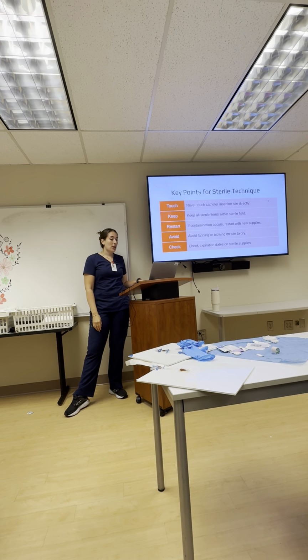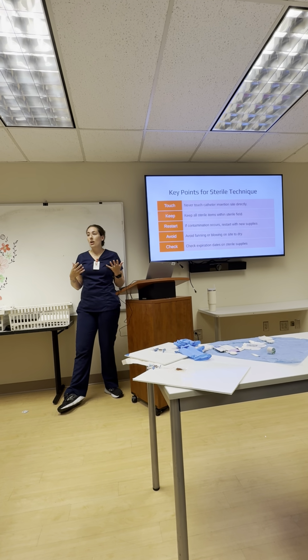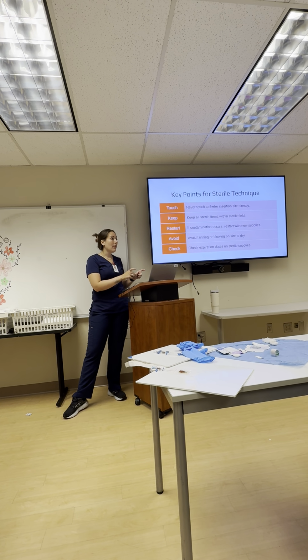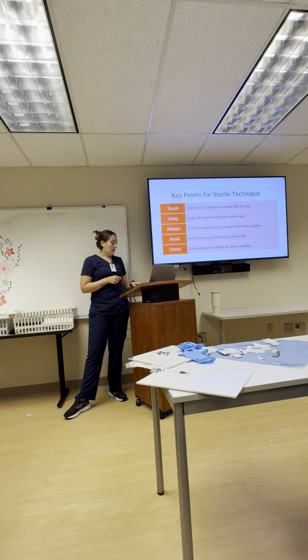And then check expiration dates on sterile supplies. Sometimes things come up or get lost in translation and it's expired. And technically, if a supply is expired, it's no longer sterile. So we just want to make sure we're looking at that. And if it is expired, tossing it and getting a non-expired kit.